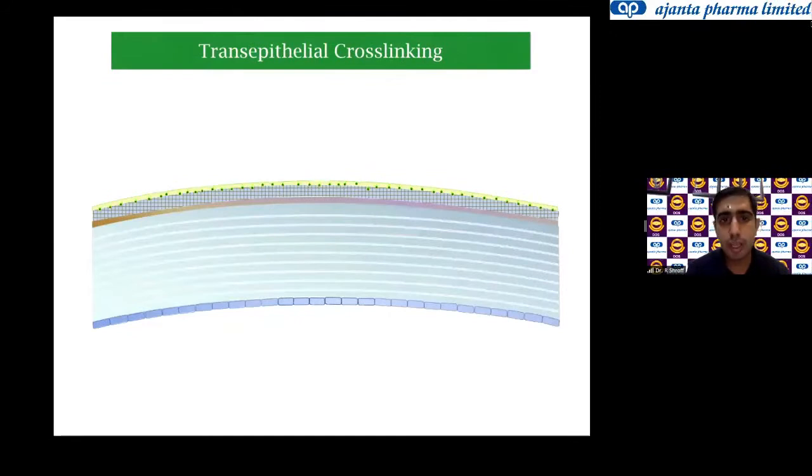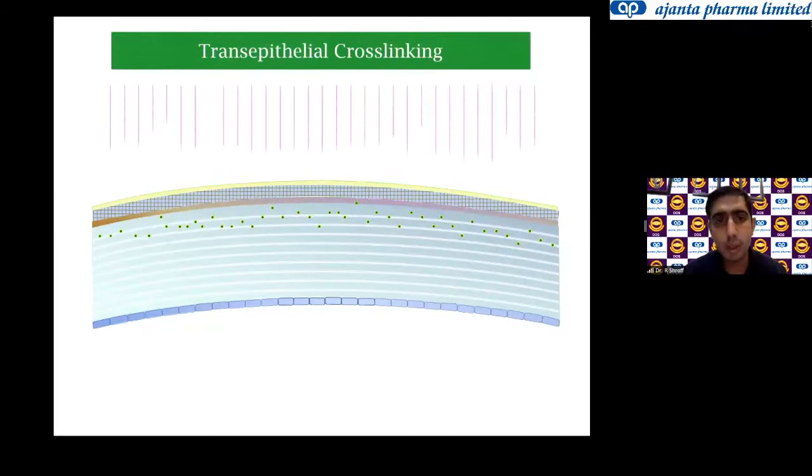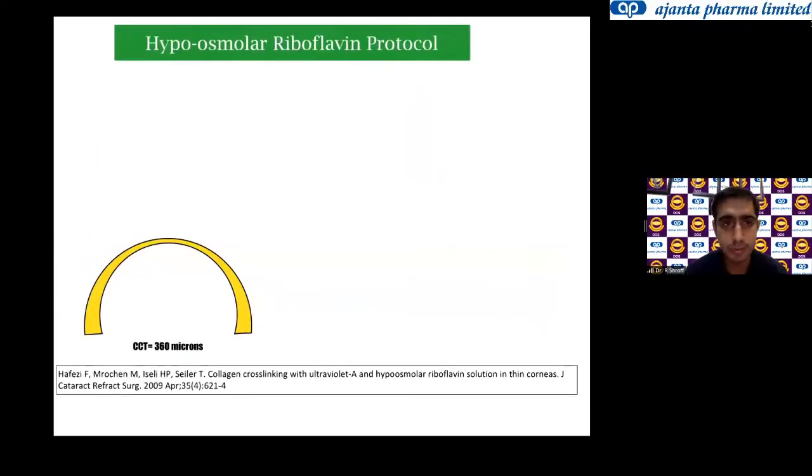Now, the issue with transepithelial cross-linking still is that the epithelium is still a barrier, and the cross-linking effect tends to be very variable, leading to failure of cross-linking in these cases, particularly in pediatric cases. As of now, I am not using this technique anymore.